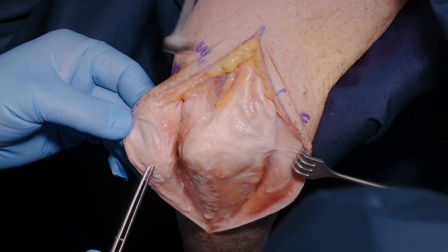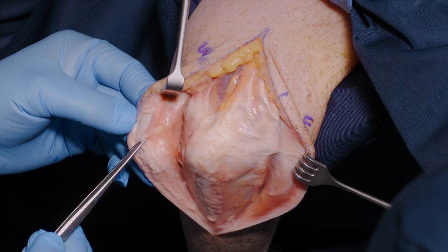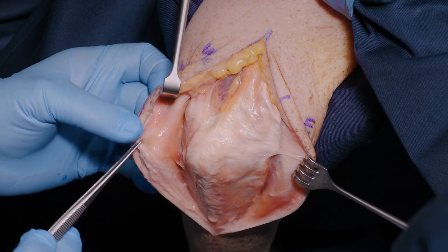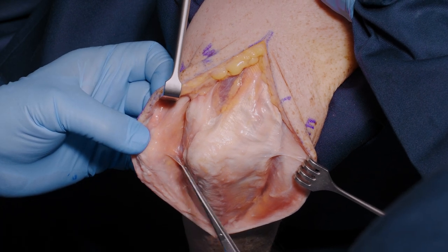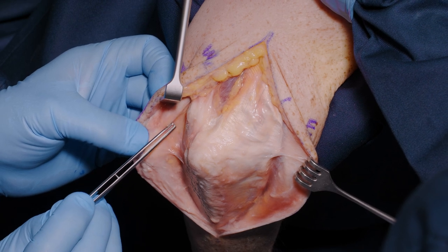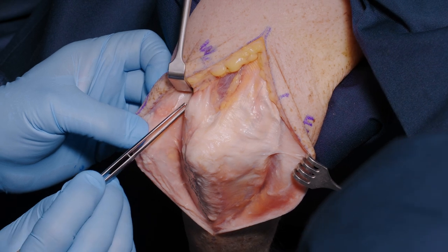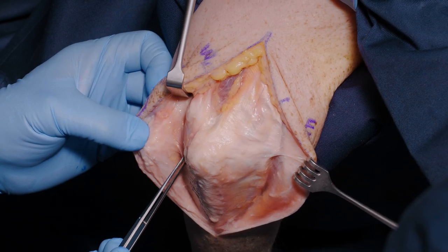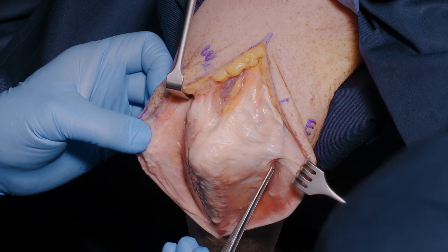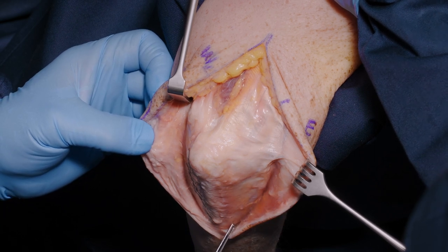Here we have elevated skin flaps laterally and medially. We have deliberately kept the olecranon bursa tissue with the skin to keep the skin strong, elevating the bursa off the periosteum of the proximal ulna, and elevated both flaps to their natural reflection from the fascial attachment to the antebrachial fascia, where the blood vessels come through — so we don't want to dissect more than that.